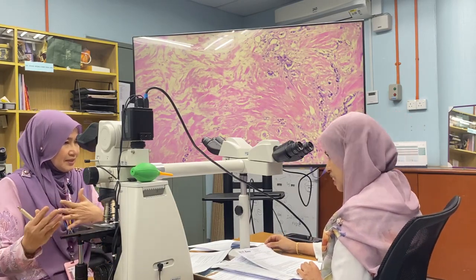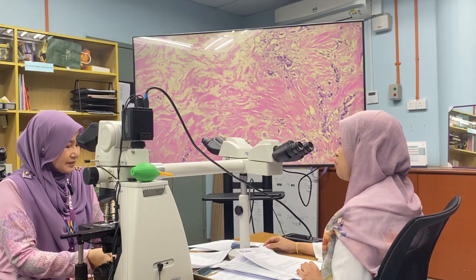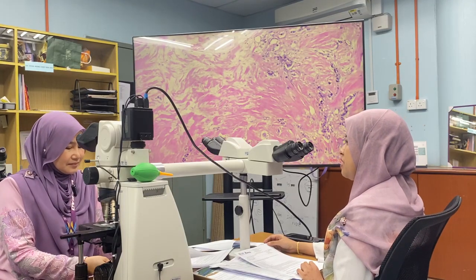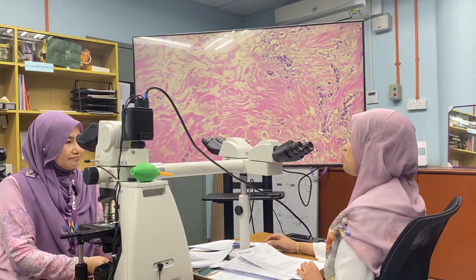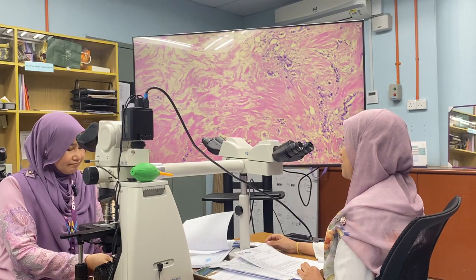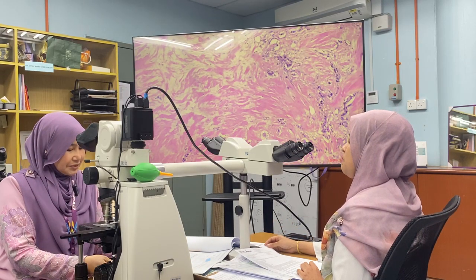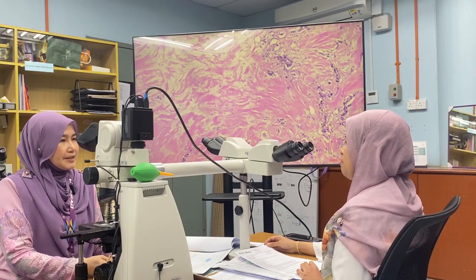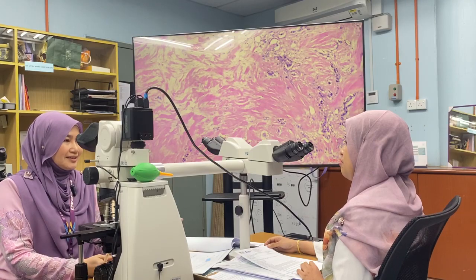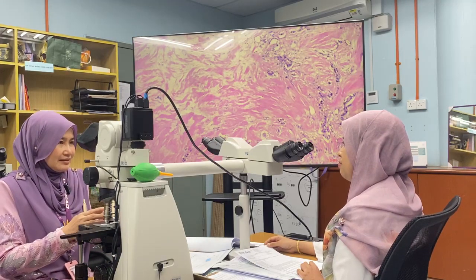Fibrosis maybe in gross, and then microscopic, we can see the fibrosis, inflammation, histiocytes, and tumor cell necrosis. Chronic inflammation, and sometimes they can have a histiocytic reaction. There's a lot of histiocytes in that place, right?